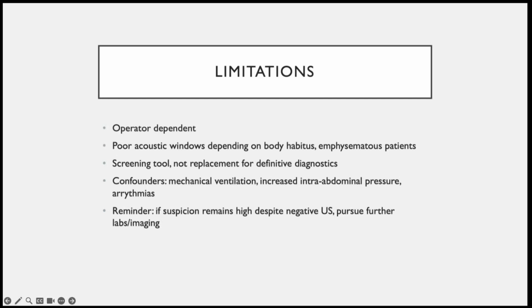Some limitations of this exam: it's operator dependent, so make sure that you practice. Sometimes, depending on different patient factors, you can get poor acoustic windows, depending on body habitus, or if your patient has COPD and they're emphysematous. And again, this is a screening tool. It does not replace definitive diagnostics with your labs and other imaging.